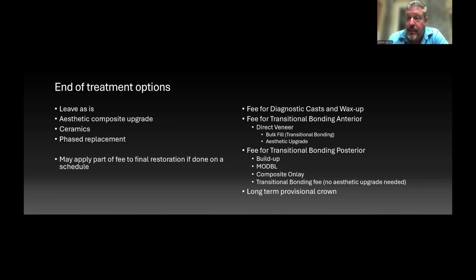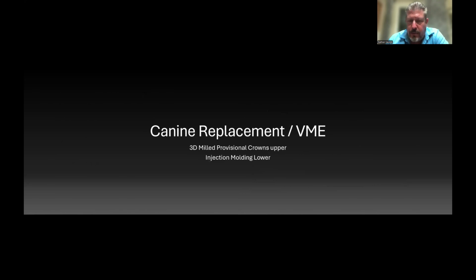It has to be like 6 months or something, and I'm bonding it onto the tooth so that later when I go to do the final ceramic on that and replace it, I'm just prepping a crown. I just prep it. And whatever I put on there becomes my buildup. And I just make sure I have clean margins around the side. So let's look at a couple cases.